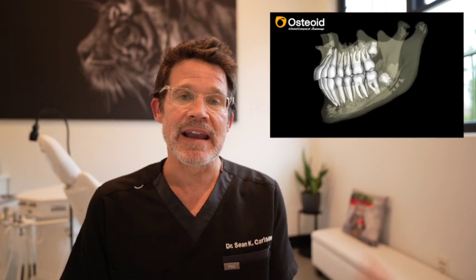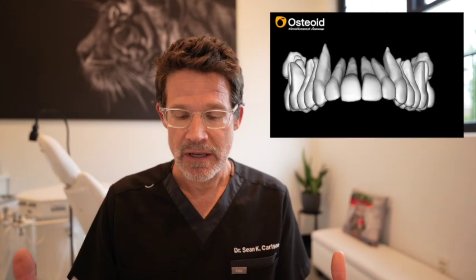And a lot of people, when they think of 3D imaging and surface mapping like Invivo models do and like Osteoid does with these CBCTs, when you surface map the teeth and the jaws, a lot of times people think this is important for doctors. And what I've found and the way we've used it in our orthodontic practice for over 20 years is it's a communication tool for patients.